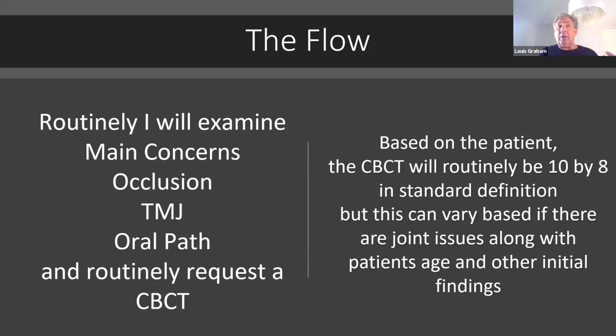Now, routinely I use a standard dose, which I'll get into, but if it's a kid who's 17 or 18, like my kids, I do a low dose. I'll walk you through that too. If the patient has joint issues, and I'm going to work with my buddy Tony tomorrow on a case in my practice, and we're going to look at joints, I take a larger scan of 15 by 13.